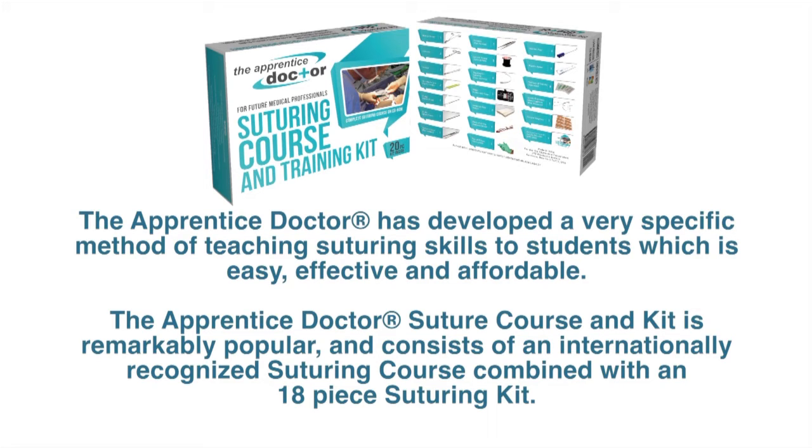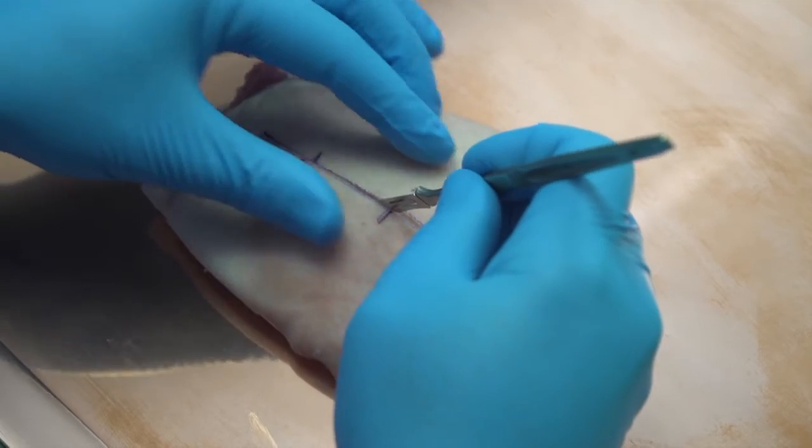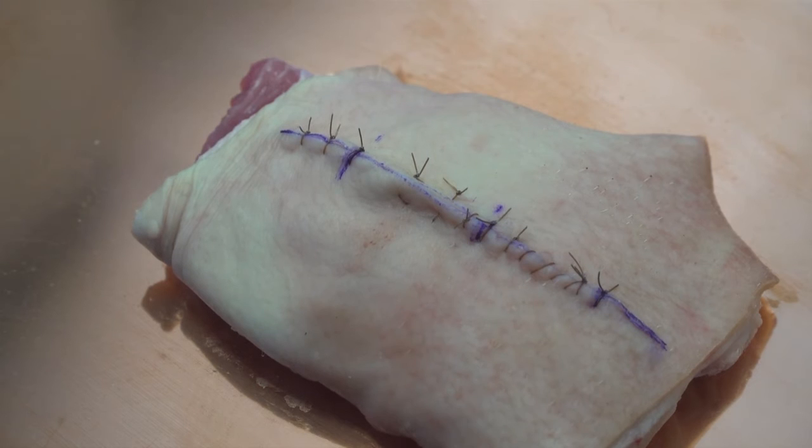an 18-piece suturing kit. Once students have mastered the basic surgical knot-tying techniques, they are ready to start practicing the various basic suturing techniques like interrupted, mattress and running sutures.